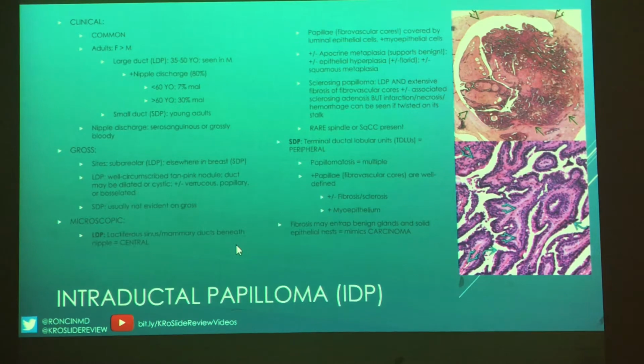When we say something like papillomatosis, those are usually patients that technically it would say more than 2 papillomas, but really they have papillomas everywhere. Like when you get the excision, it's just a sea of papillomas all over. And many of them might even be microscopic, and I don't have that in here, but microscopic would be less than 2 millimeters in size.